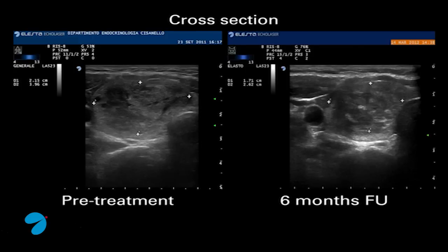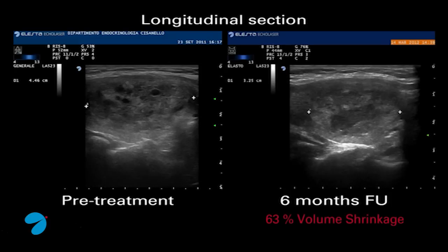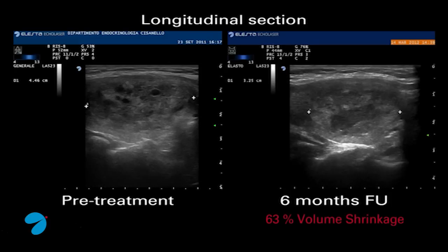Ultrasound images of the nodule in transversal and sagittal plane show the 63% volume shrinkage at six months after treatment.